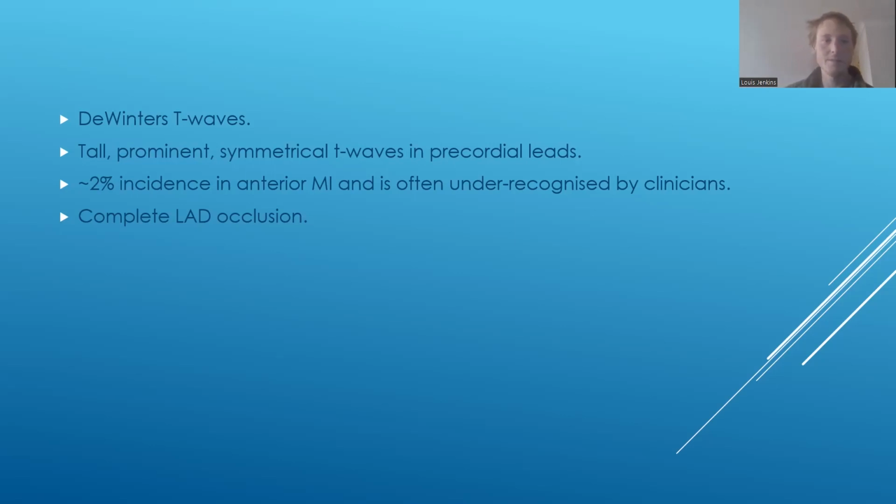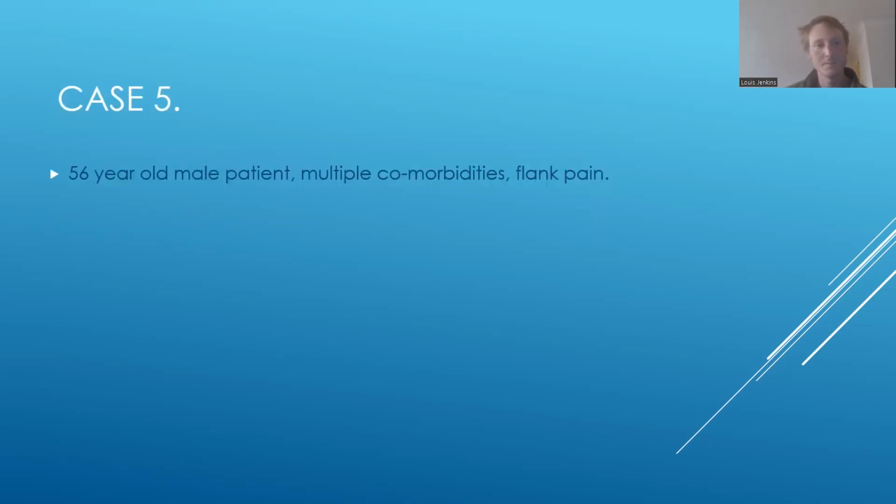But yeah, De Winter's. This is a good one to know about. I have never seen this on the road. It's relatively rare, but this is good to know about.